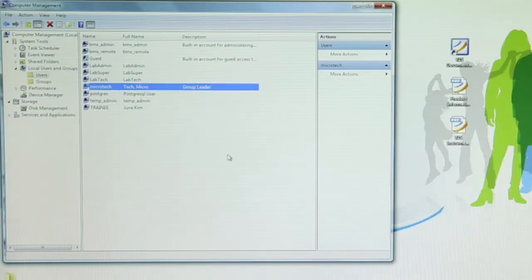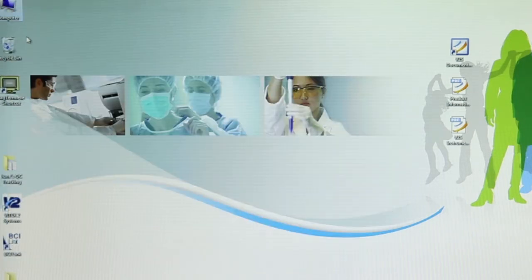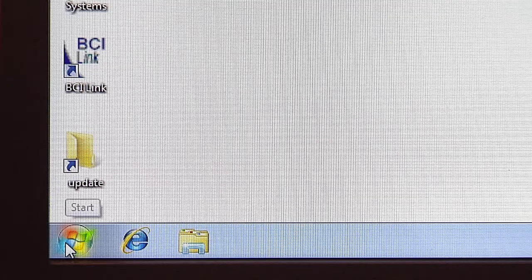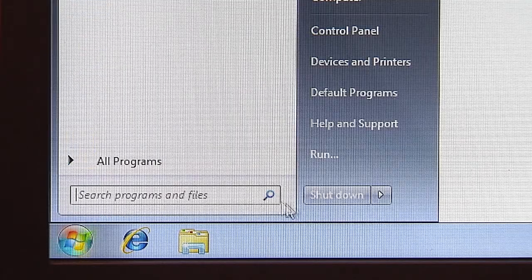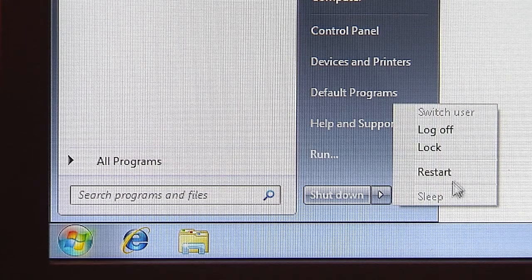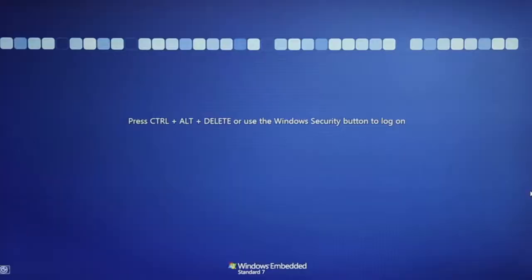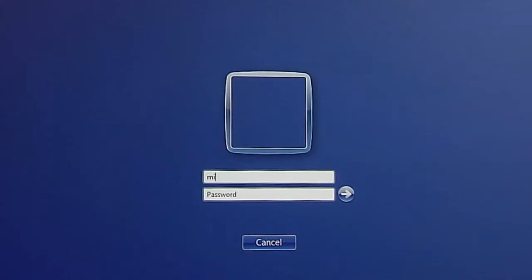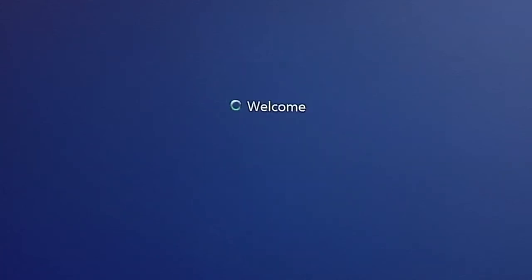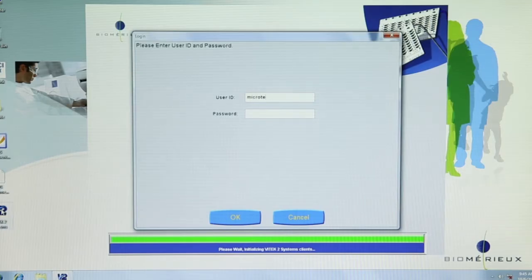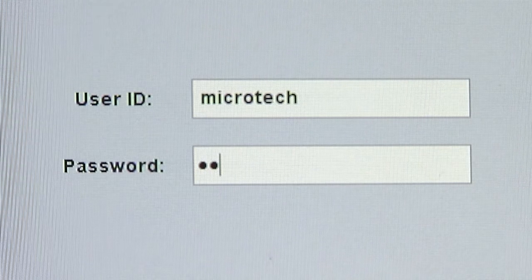Close all open windows. To access the system using the new password, log off the computer. Click on the Start button in the lower left corner and click on Log Off. Press Control-Alt-Delete. Log in to Windows using the new password. Log in to Vitek 2 System Software using the new password.